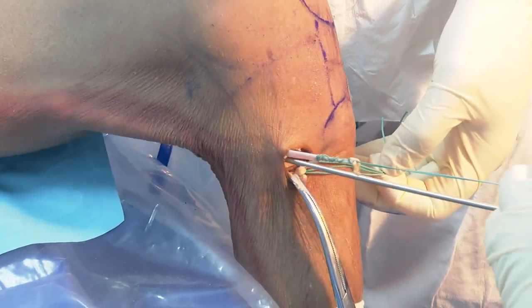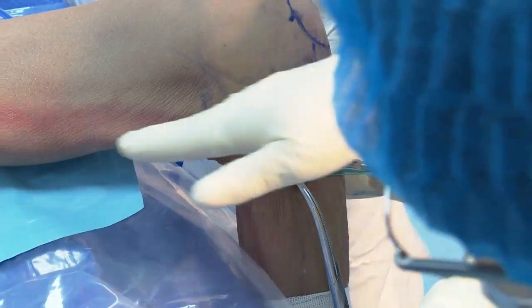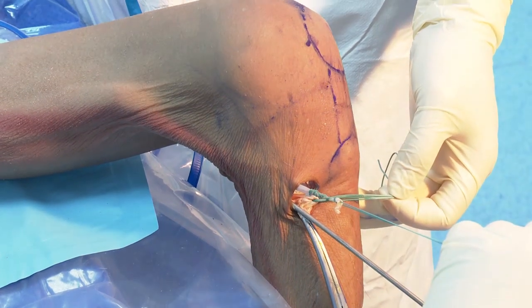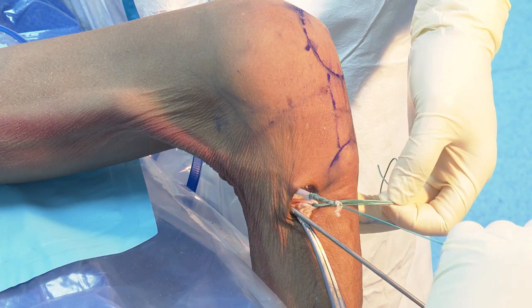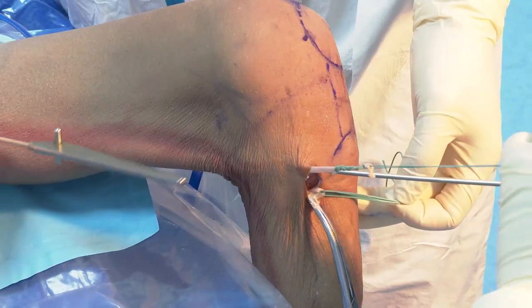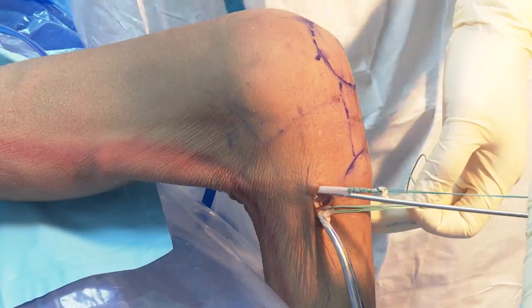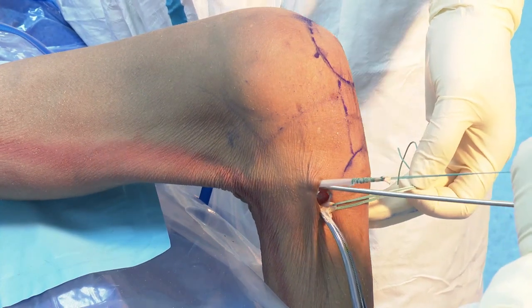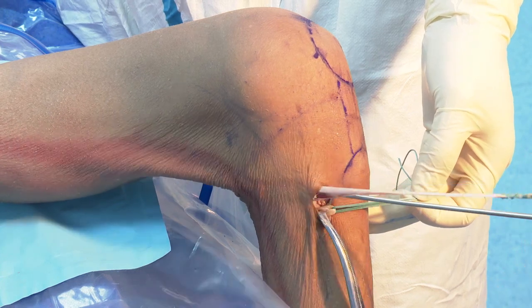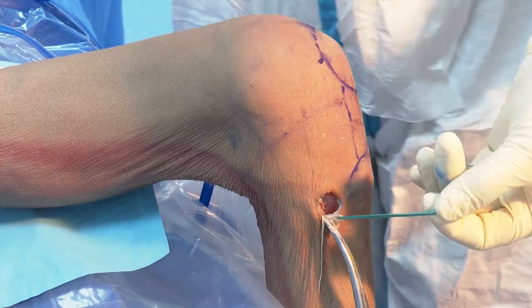Good. Okay. So we go in this way. Okay. Then the tendon stripper. So the trick is you just hold steady, not too much tension, and the line must be parallel. You should not go angulated like this, okay, you can cut the tendon. You see, angulation is not good. The angle is very important, so look at the line of the tool, right? The line of the tendon. If the stripper deviates in angle, it will cut into the muscle. And here hold it steady. Okay. Left hand. And you see here it slowly goes. See, slowly go. The stripper is slowly advanced. Okay, like that. Okay, good. Done.